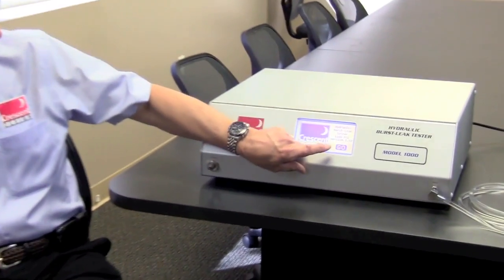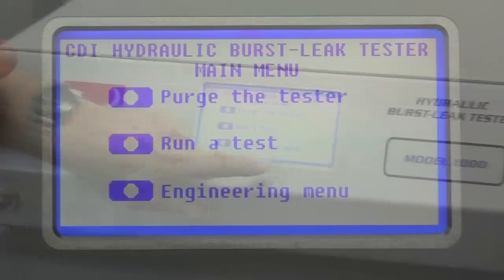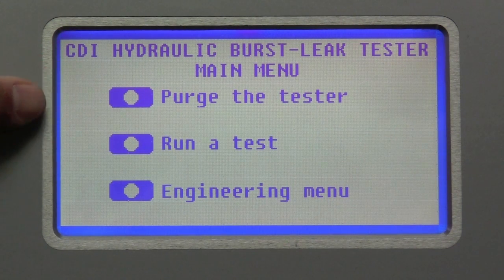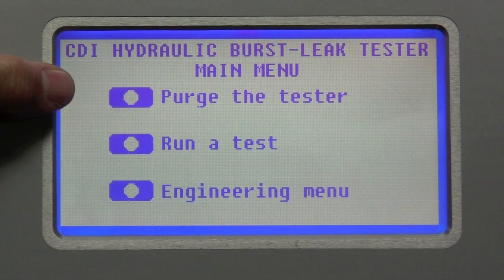I'm now going to select the main menu to begin the demonstration. So here we have the main screen with three choices. Purge the tester, where we purge the air out of the tester once every day.